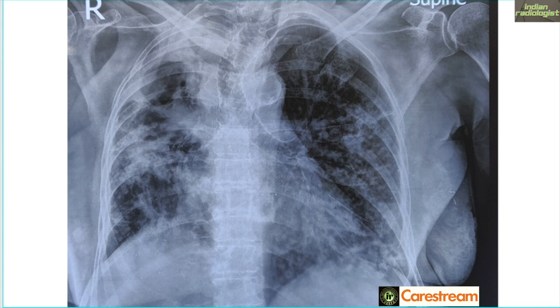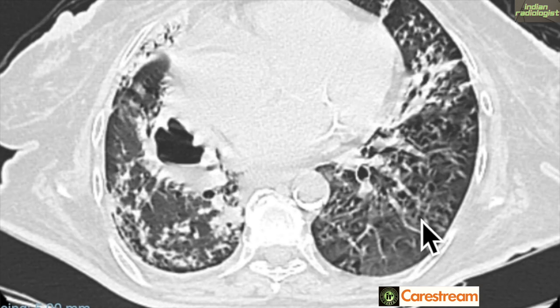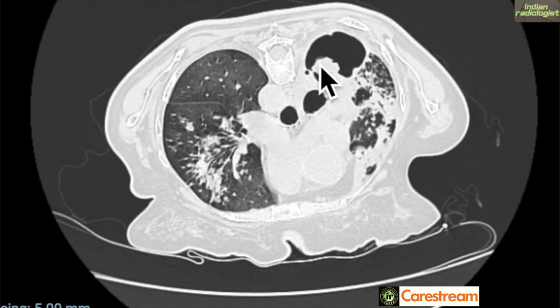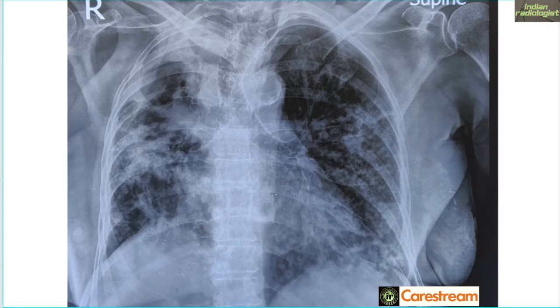This is again an ICU radiograph and we see a similar picture but on a much more severe scale. There is destruction of lung on the right side, cavity formation in the upper lobe and mid zone, and dense lesions in both mid and lower zones. A soft tissue shadow within the cavities prompted a CT scan. The CT done in supine position shows opacification within the cavity that is mobile — it has moved downwards on the prone scan. This is a fungal ball, and the diagnosis is aspergilloma.